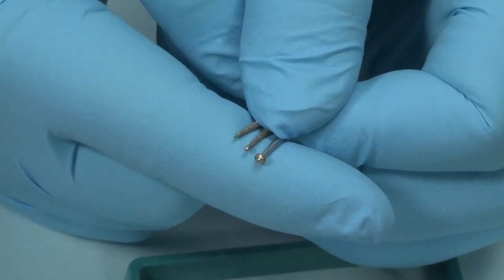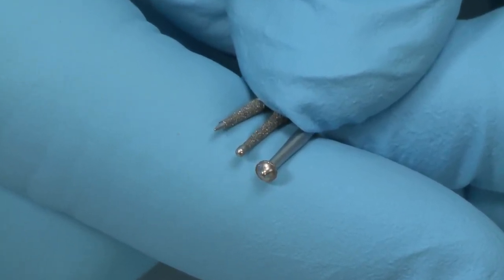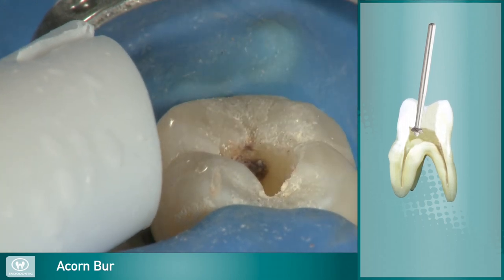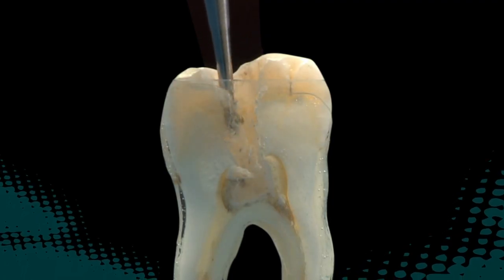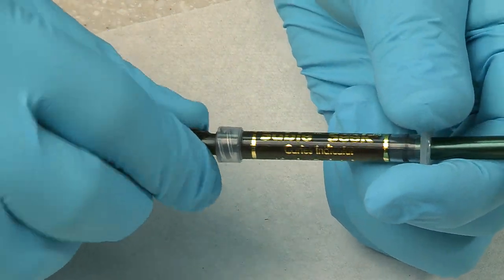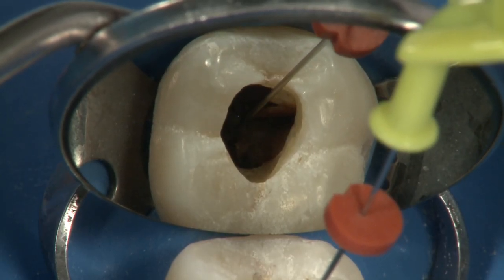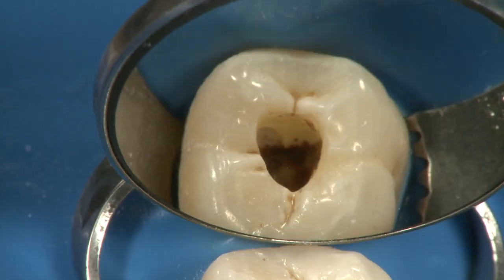The remaining access burrs feature safe-ended tips to minimize the risk of pulpal floor canal perforation or other damage. The acorn burrs, available in two sizes, are designed to remove dentin and enamel on the upstroke. This makes de-roofing the pulp chamber and removing the pulp horns safe and easy. To identify difficult-to-find canal orifices, a quality caries indicator such as SableSeq can be beneficial. SableSeq's bold green color stands in stark contrast to pulp tissues and readily identifies the location of the canal orifice.